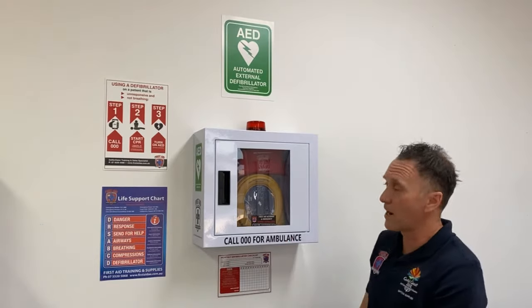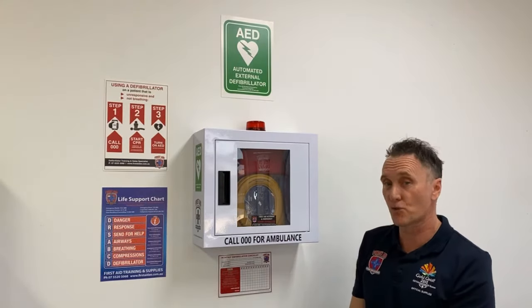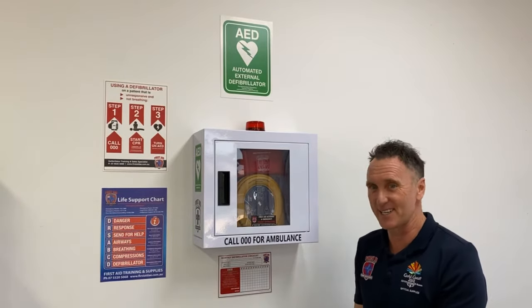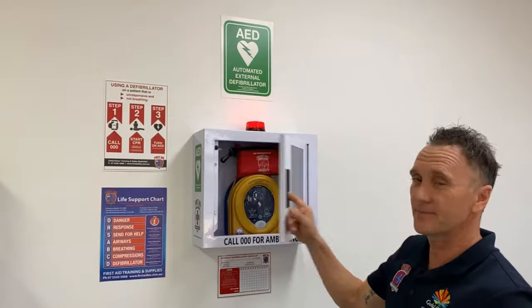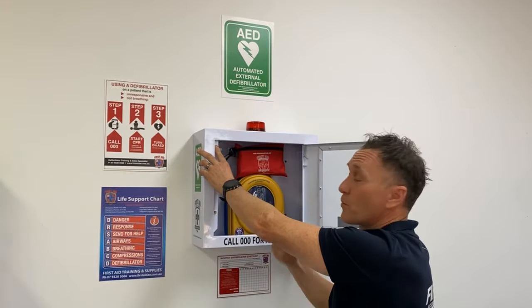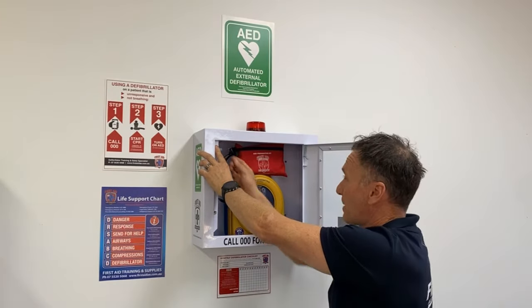We also have a full metal constructed alarmed and strobe light wall cabinet, and we recommend this because you want to know when someone's accessing your defibrillator within the workplace. Let's have a look and see how it goes. You can easily turn this off when you're servicing the device by quite simply pushing in the pressure pad.